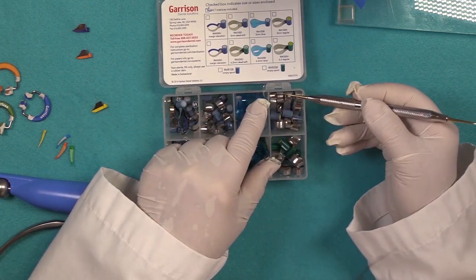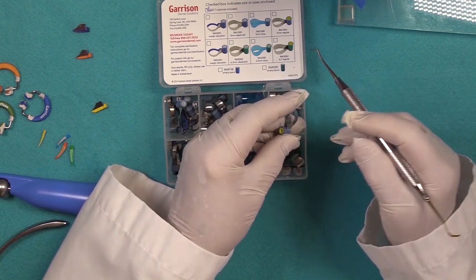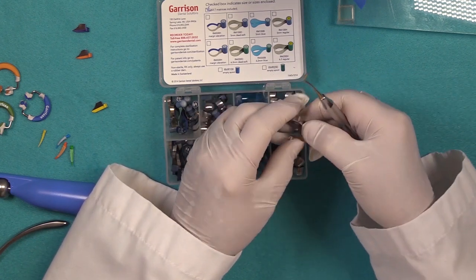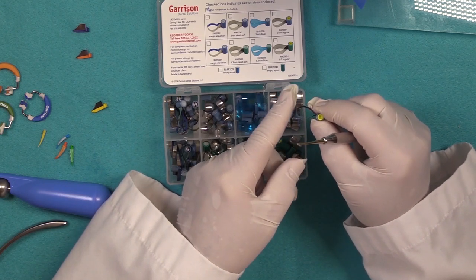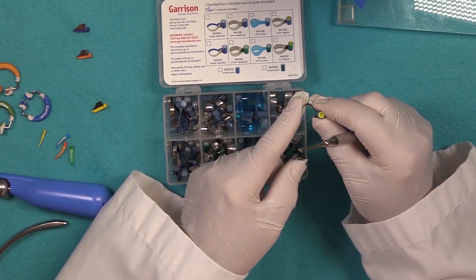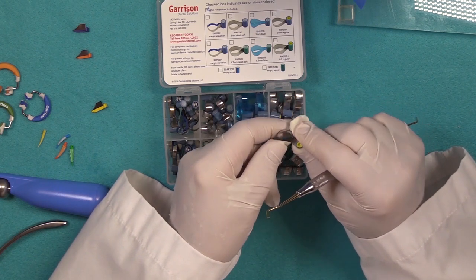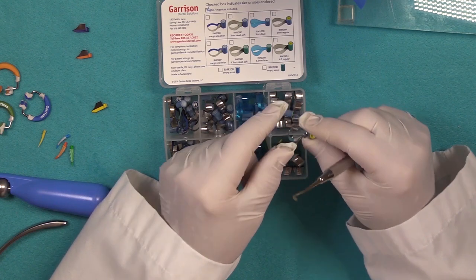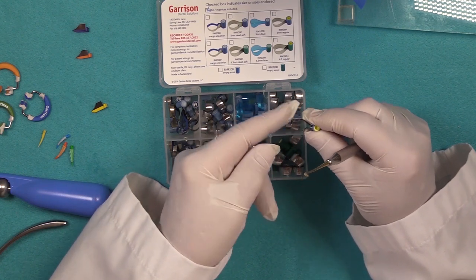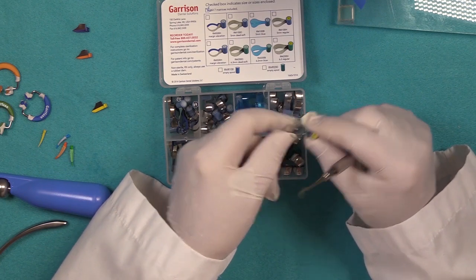Finally, you have the regular matrix system. This band is a little bit thicker — equivalent to your thick universal band. When you have a situation where you've got particularly tight areas to negotiate to get the band into place, this will make it a little bit easier to place because it is a thicker band.